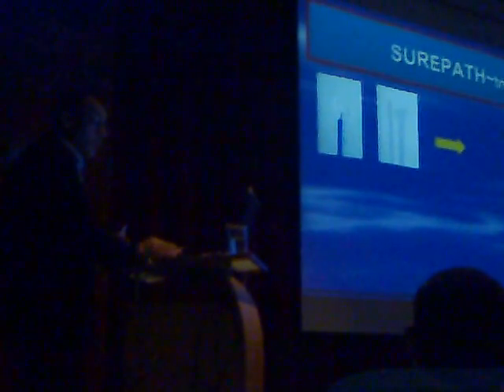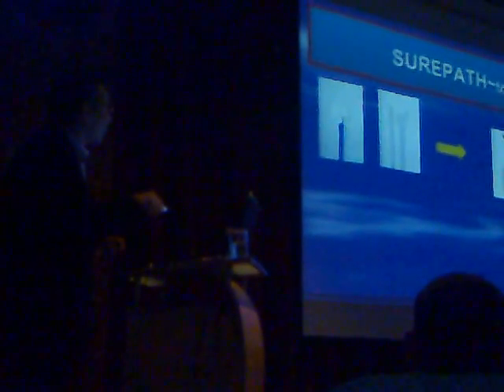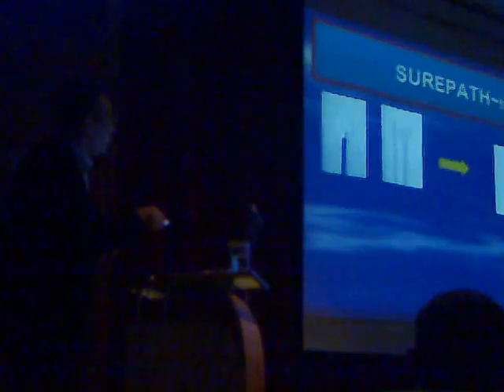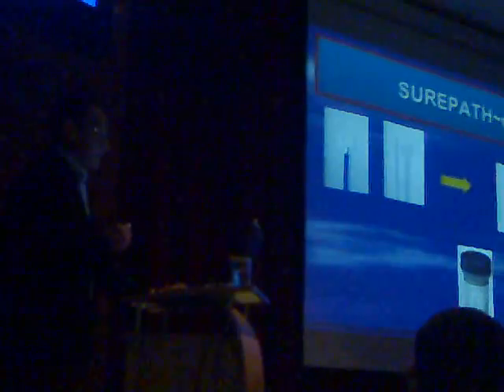Liquid-based cytology is present in the market under two trade names: SurePath, we saw the video, and ThinPrep. What is the difference? I am sorry if there is any error in the spelling or pronunciation of ThinPrep. If anyone can correct, no problem. But till now, it is ThinPrep. Here, we need to concentrate on that. The end of the spatula here is broken inside, not rinsed, but broken, and we close the vial and send it to the lab. But the principle is the same.